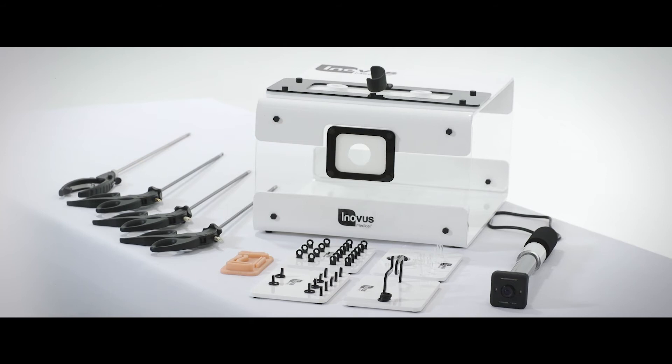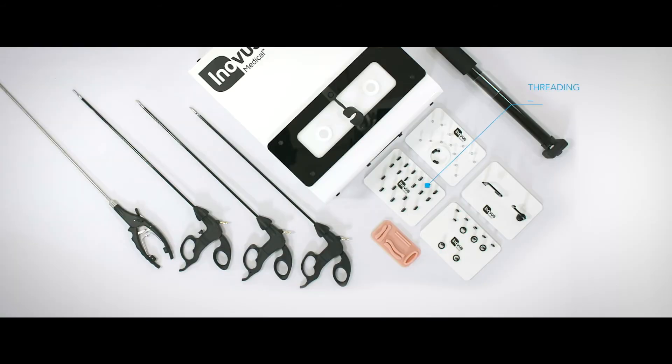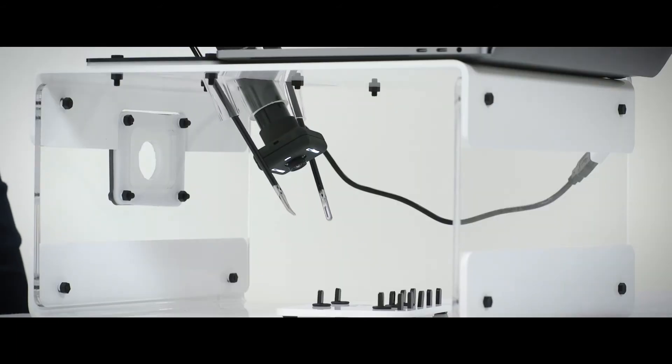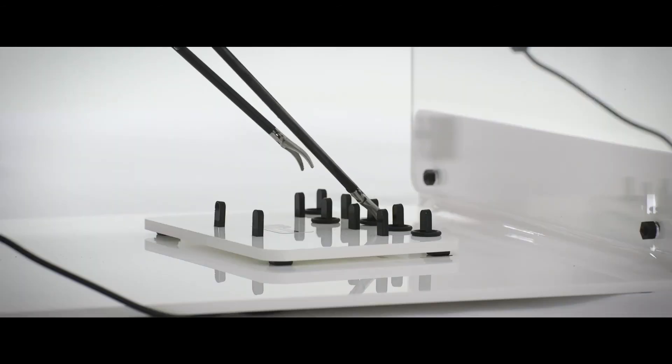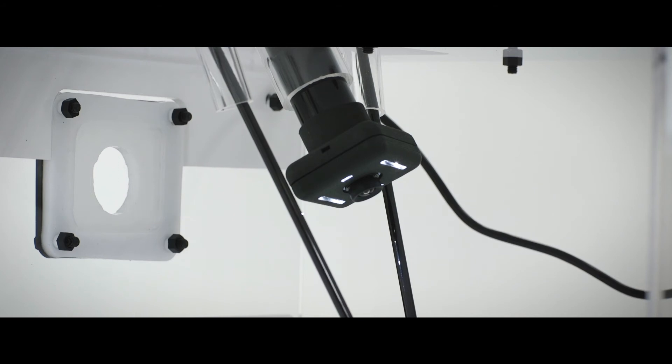The simulator comes with four basic laparoscopic skills tasks: the threading base, the ring stack base, the bead stack base, and the maze base. These tasks allow you to carry out basic through to intermediate laparoscopic skills, giving you a feeling for things like the fulcrum effect, triangulation, depth perception, and bimanual dexterity.